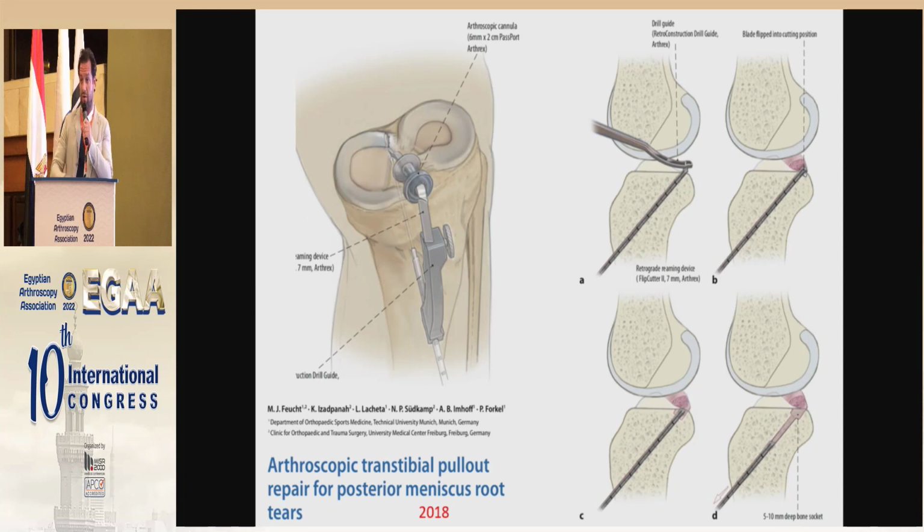So, I don't know if Professor Imhoff is also with us, but I want to thank him for his work and his school. This is the technique that we also use, especially for the medial root repair, because we prepare the bone socket on the medial side with this kind of procedure.